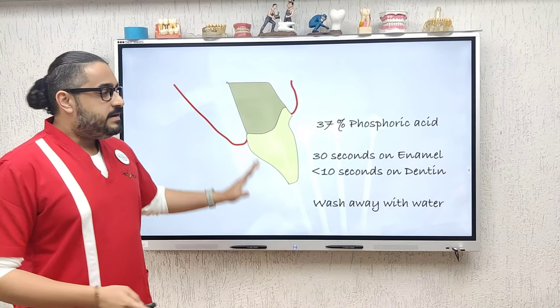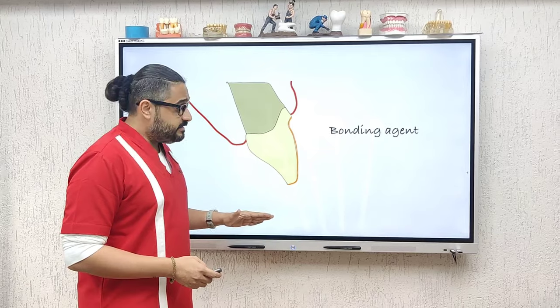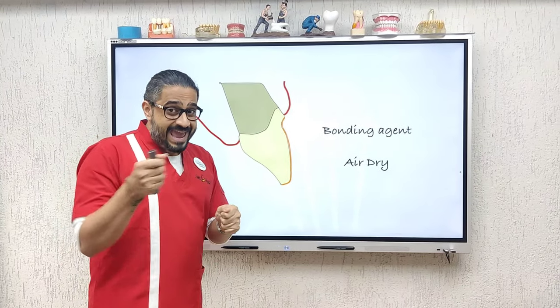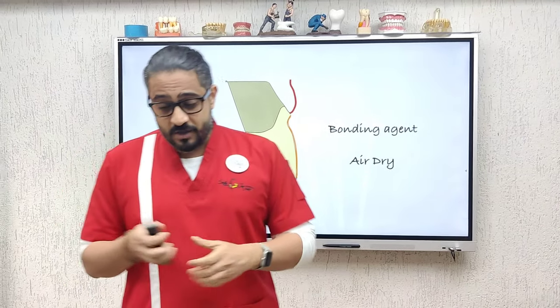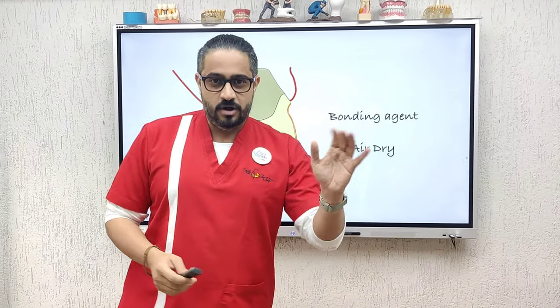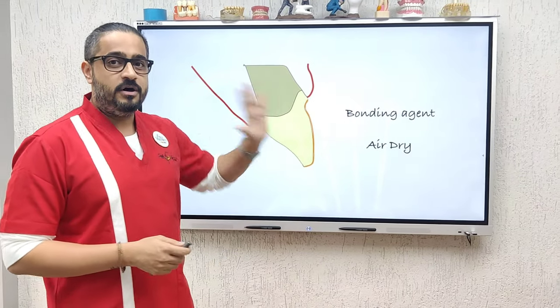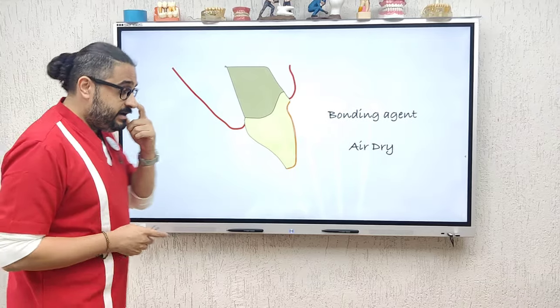You'll have a frosty white appearance again. Now take your bonding agent and scrub it onto the entire surface. Make sure you air thin the bonding agent using adequate pressure so that any ripples created on the surface are all gone. No ripples means all the solvent is gone and you have pure bonding agent available for adhesion.